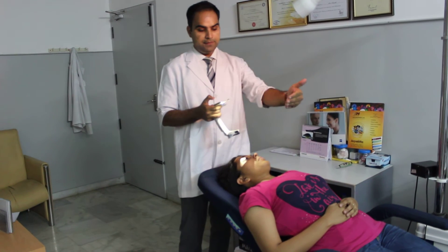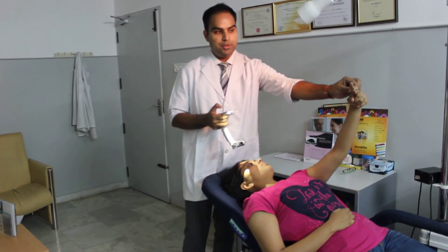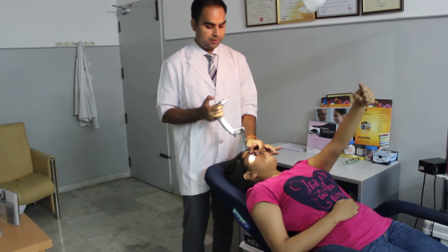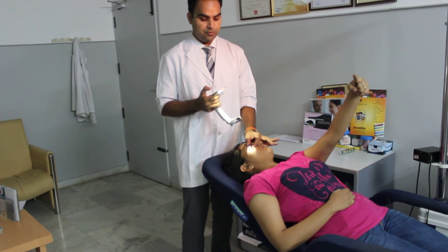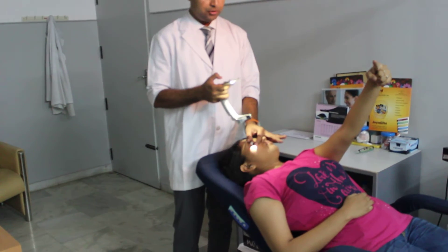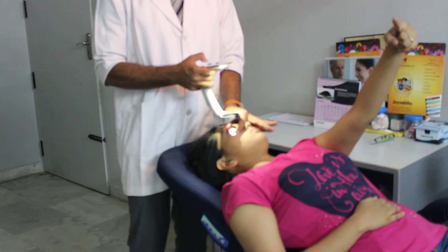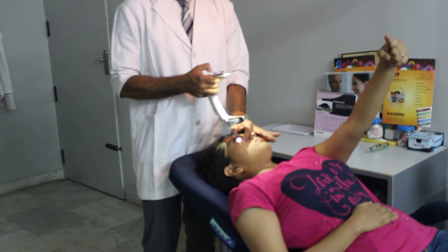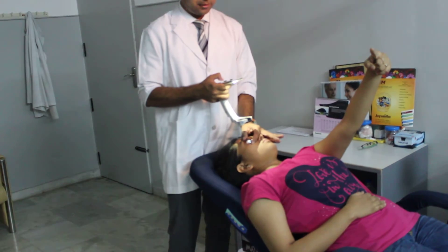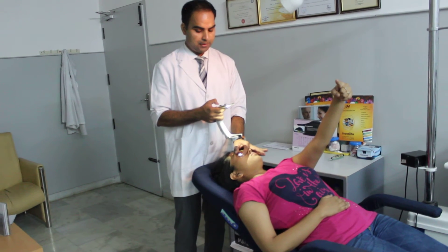If you want to take the inferior retinal picture, ask the patient to look slightly inferiorly and position yourself just opposite. Use your other hand to open the patient's eye — that makes a lot of difference. Again, go close to the patient's eye, slowly come up till the entire screen is full of the image, and hit the capture button.